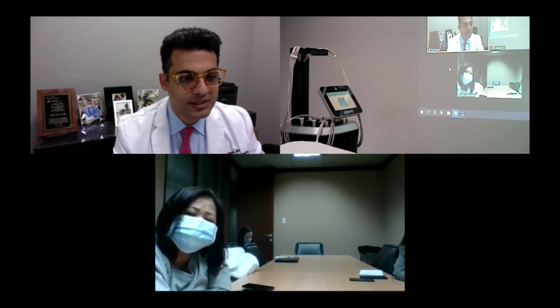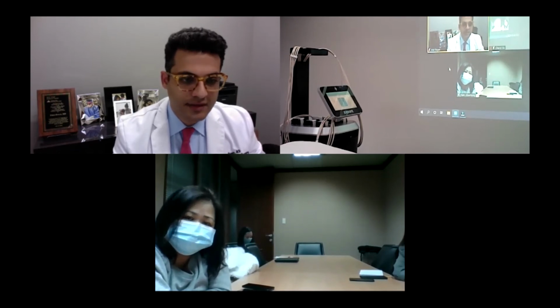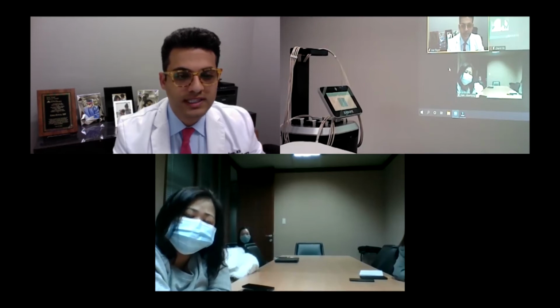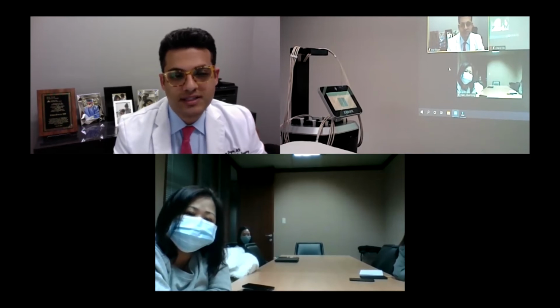Now, normally what I tell patients, and they understand this, is, listen, this is not an immediate result. Radio frequency is going to take 4 to 6 weeks to see a result. And I even think getting one of these cameras that shows volume reduction is very powerful, because I take pictures of the patients before and after, and consistently they will see anywhere from a 400 to 800 cc reduction. If you do it objectively like that, it's a very objective result.